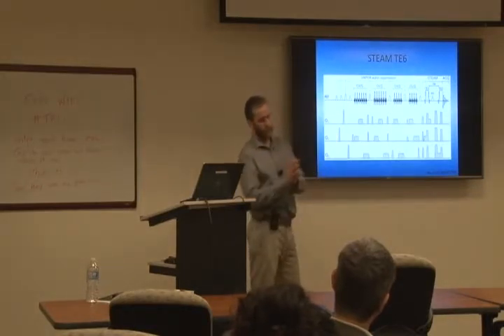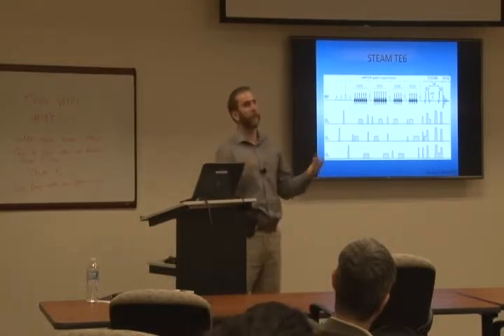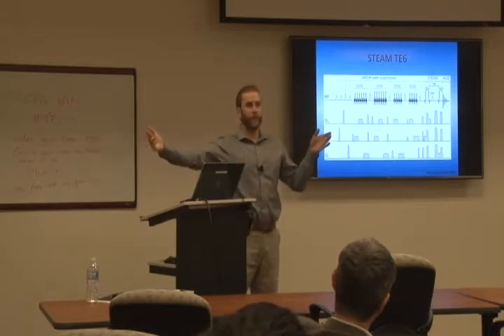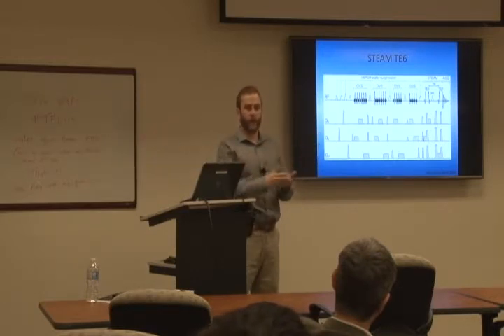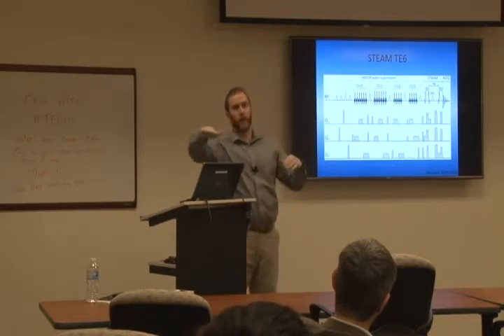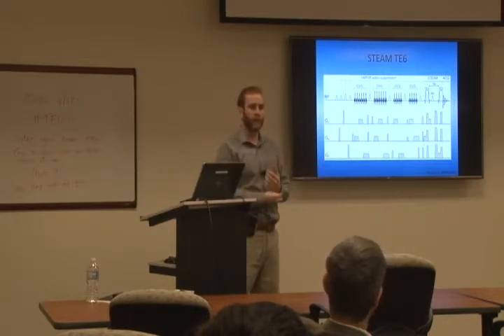So what you do is you give it a range of flip angles. You start at this flip angle, range to 50 degrees out with every 5-10 degree increments, and then it'll pop up on the screen and it'll show you the decrease in water, and then you select whether you're happy with the amount of water that's been suppressed.